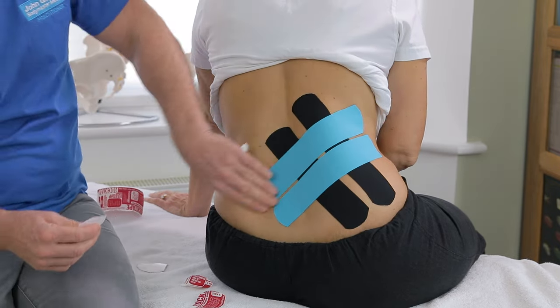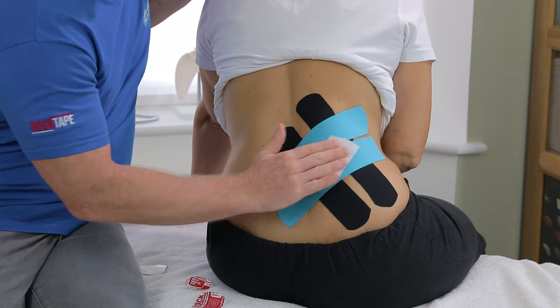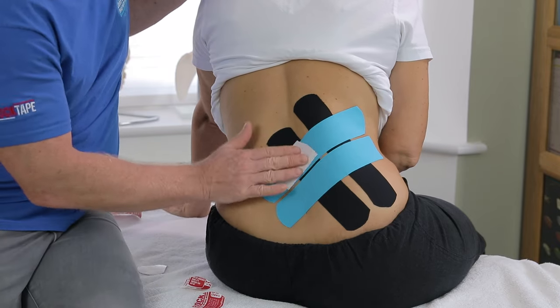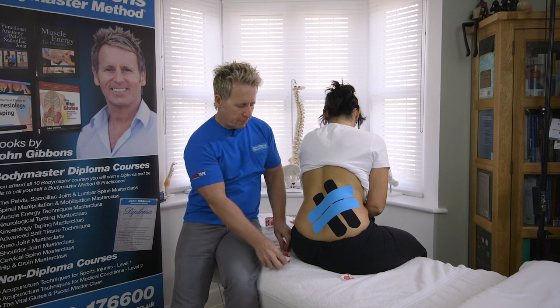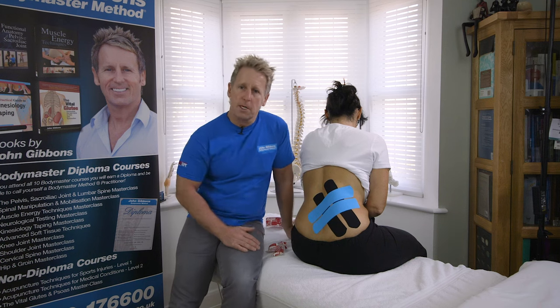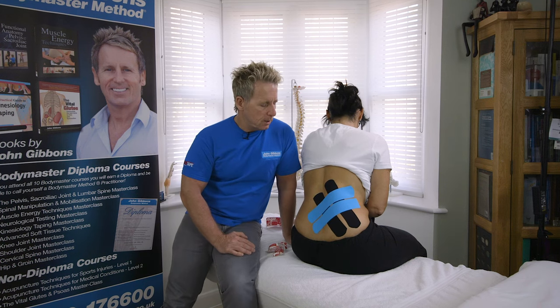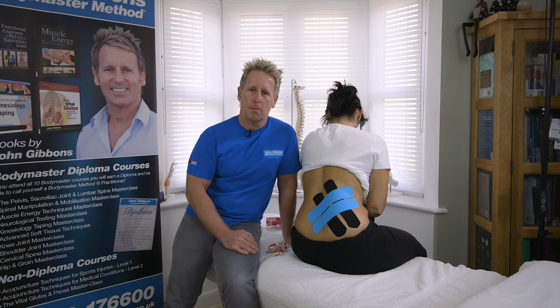Once you've done the tape, use the back of the tape to heat activate it — this just makes the adhesive stick a bit better. You can normally leave it on for three to five days, and then reassess the patient afterwards to see if it's helped. I hope you enjoyed the K-tip video for the quadratus lumborum muscle.